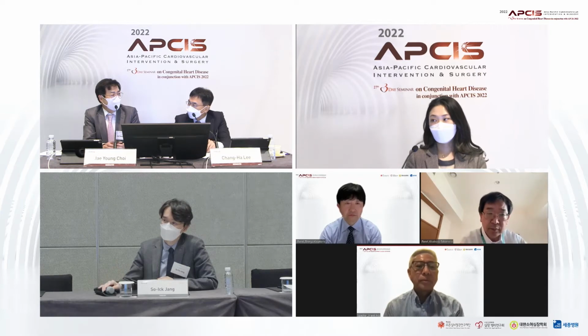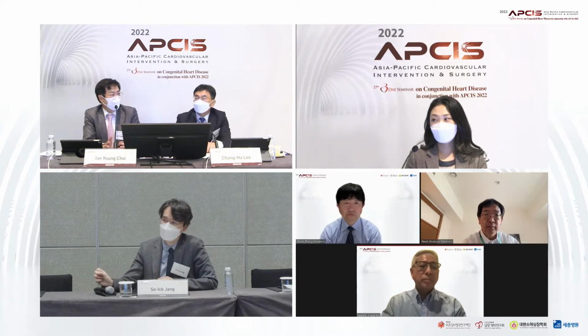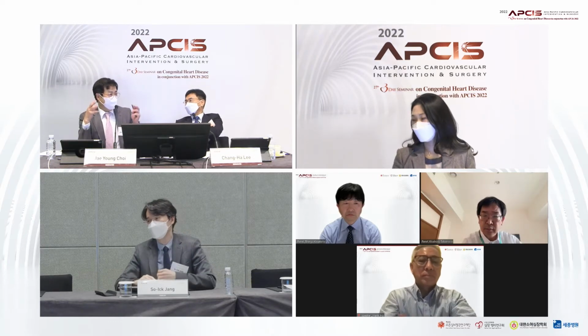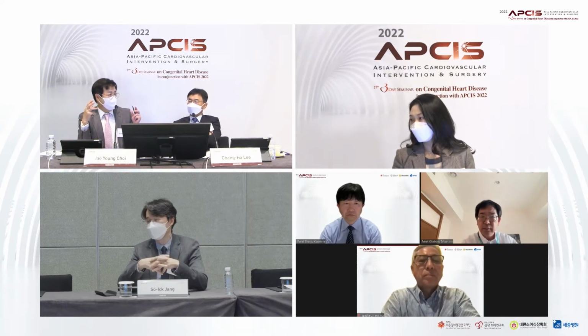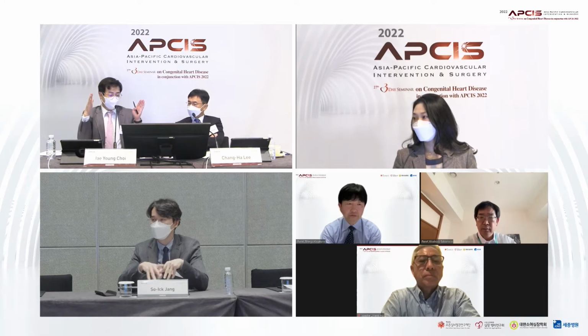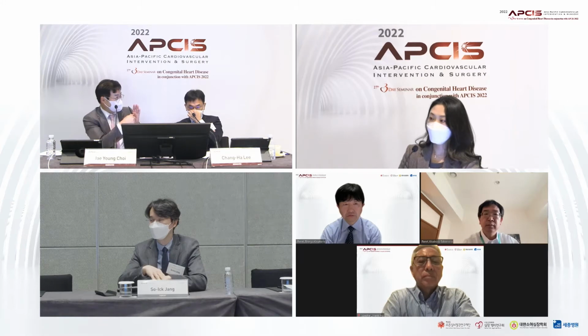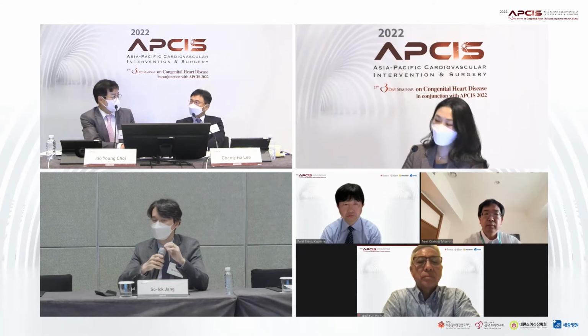As I told you while talking about the remodeling of the stent, if you use a longer and larger balloon, then the stent can compress. Then it forms a napkin ring, and then it couldn't be unzipped.